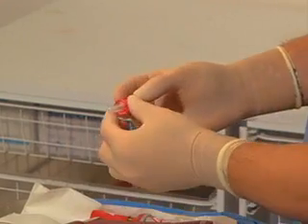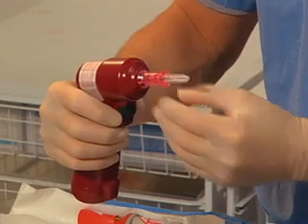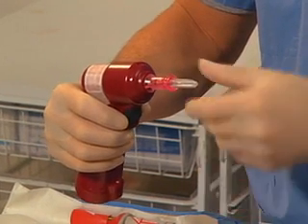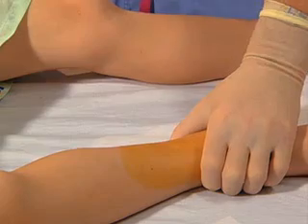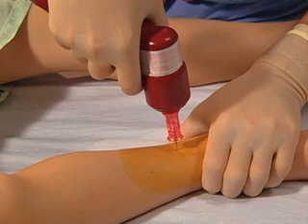Remove the needle from its protective container. Attach the needle set to the driver, allowing the magnetic pull to hold it in place. Turn the safety cap clockwise to remove it. Pull it off the needle. Place the needle against the skin overlying the site, 1 to 2 centimeters from the adjacent physis.